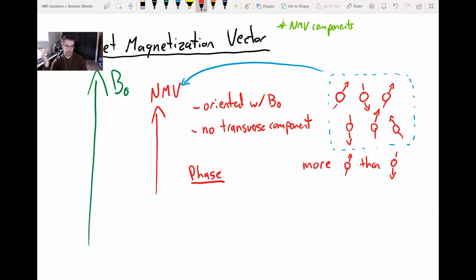If we think of this as basically the path of least resistance, like what determines how a river flows, the particles that we're interacting with all want to just do the easiest thing possible. They're lazy or efficient, depending on your mindset on any given day. So as many hydrogen atoms as possible want to be oriented upwards just because it's slightly easier for them.